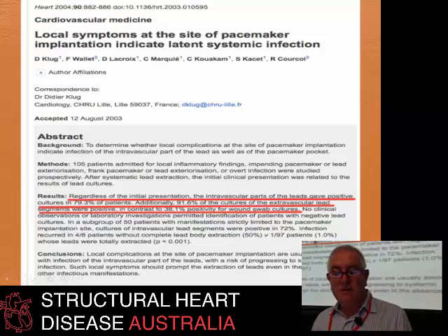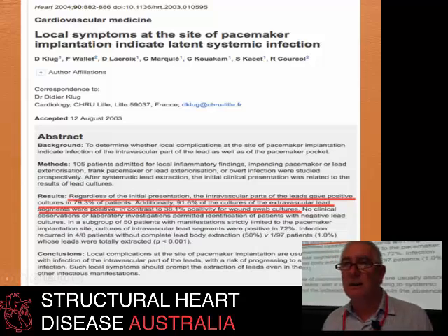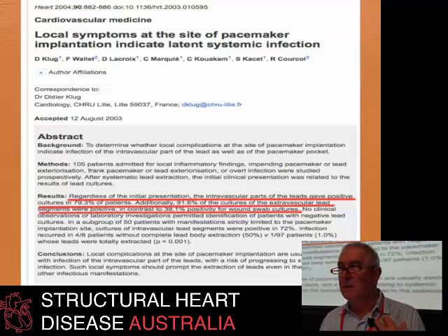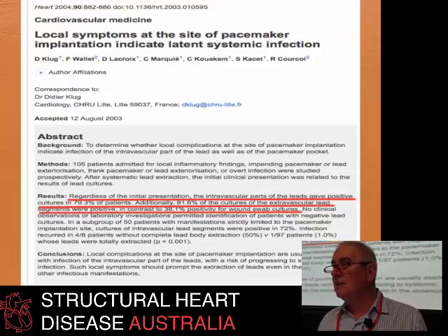Additionally, 90% of the cultures of the leads in the pocket, so the extravascular leads, were also positive, yet a wound swab in the pocket done at the time of surgery was only positive in 40% of cases. So basically what that says is that if you've got a pocket that looked infected, it's very likely that everything's infected. And the idea that used to be propagated years ago that you just locally excise it, wash it out and stick it beneath the muscle is probably not good enough.